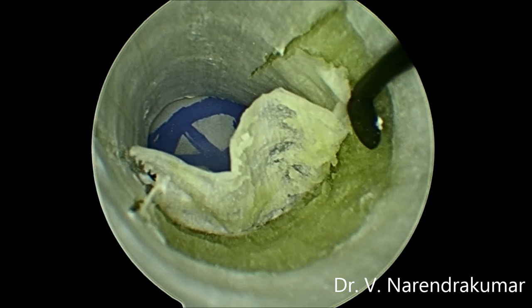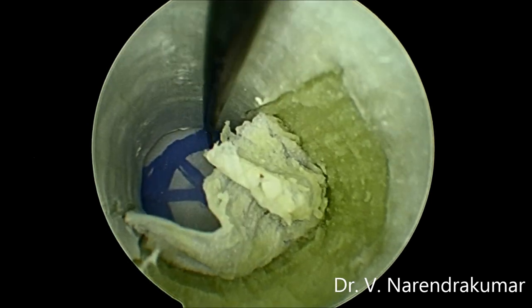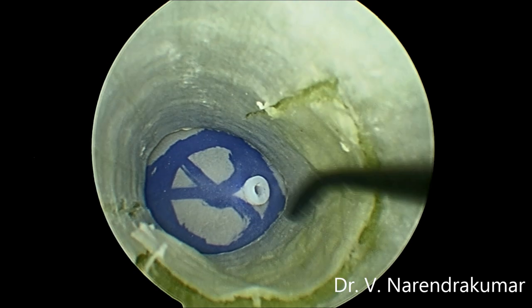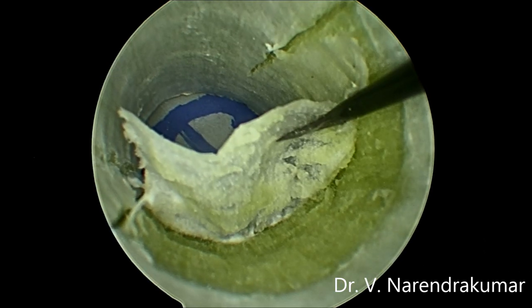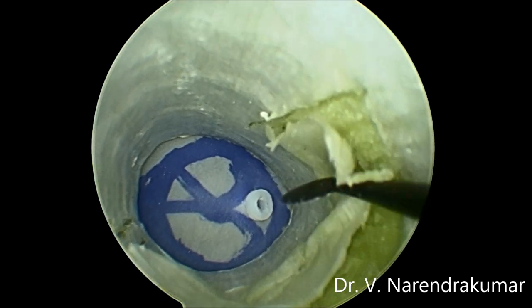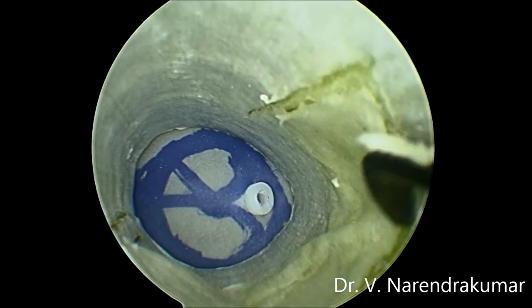Exactly the same — look at how thin it is, very delicate. You all should also try the same. Various types of incisions, various locations — you can try everything here.